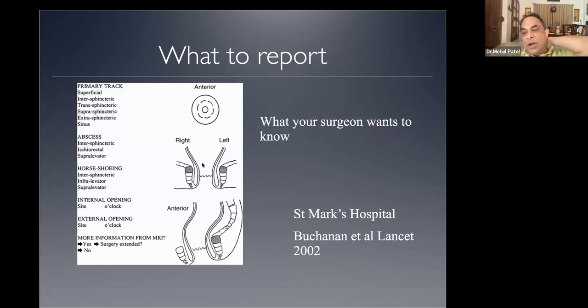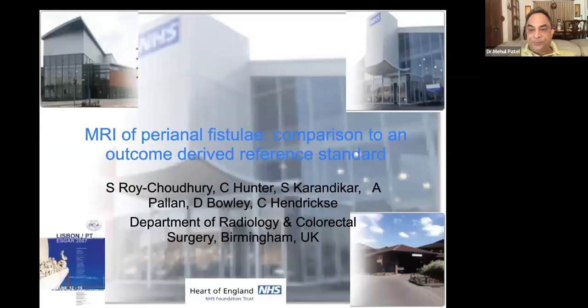When you talk about multiple openings on a fistula tract, let me see if I've got a picture. One second. Okay.